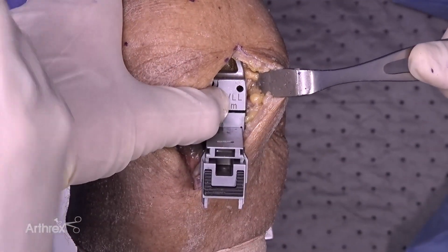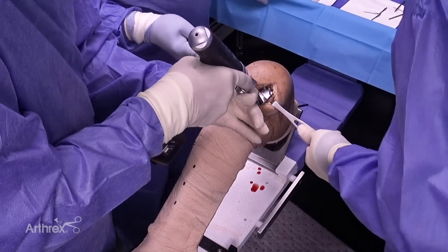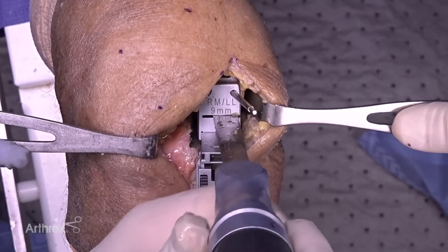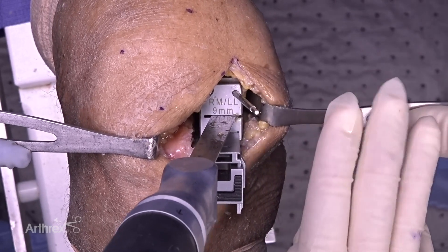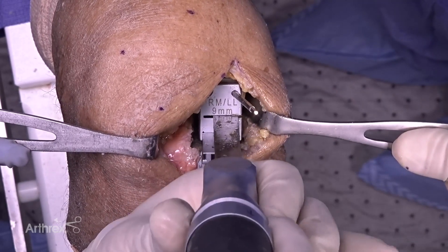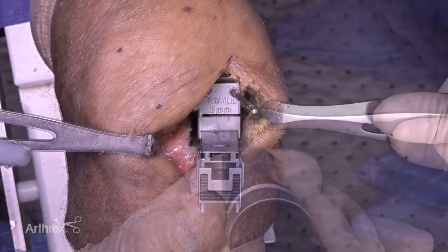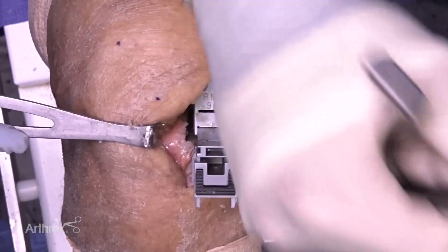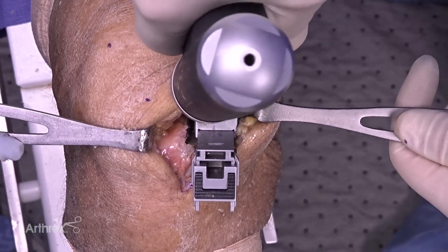I will flex and extend until it sits flush on the distal femoral cut. You can see through the window in the guide that it is flushed down onto the bone. Once it's in the correct spot, we pin it into place. It is a slotted cutting guide, captured on the lateral side. The medial side has a retractor protecting the MCL. Now we can remove our guide, and if we need to do a freshen-up cut, we certainly can.